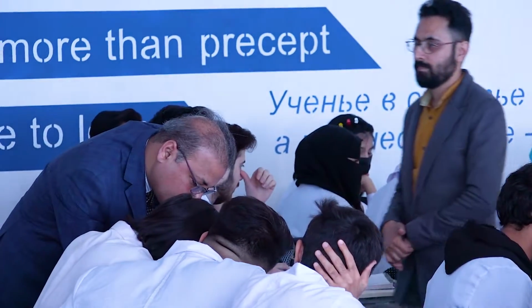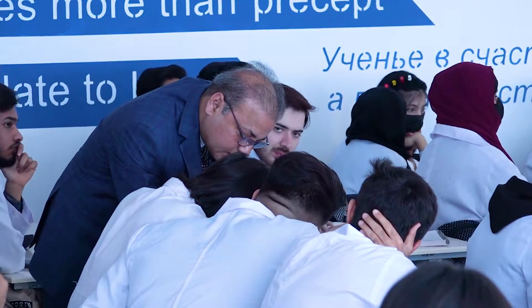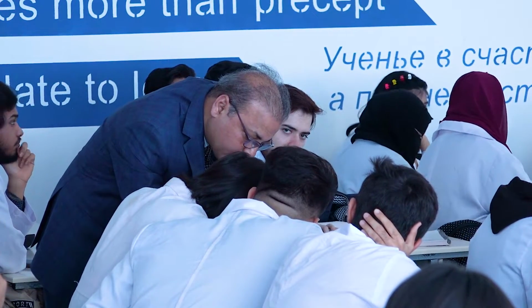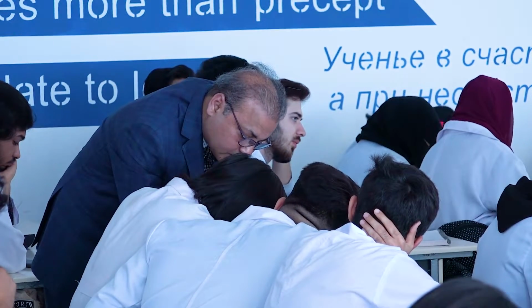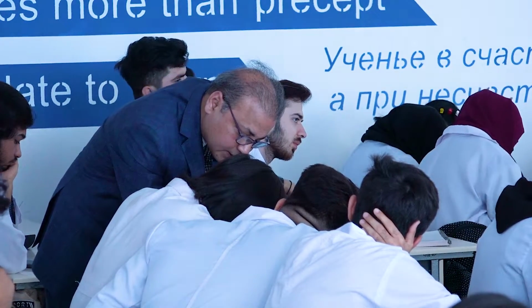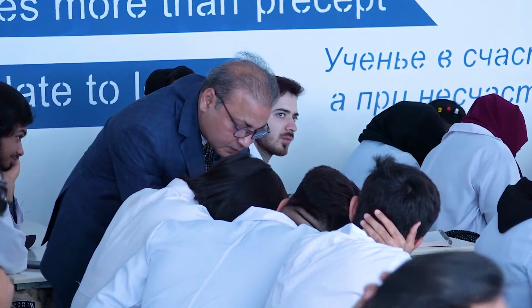You just see where Q and T finish. In between, 2 big boxes or less than 2 means 25 mm per second. If above 2 big boxes, it means 50 mm per second.